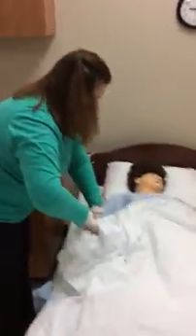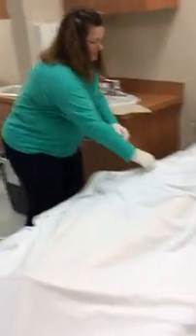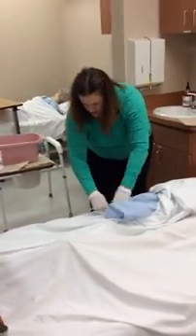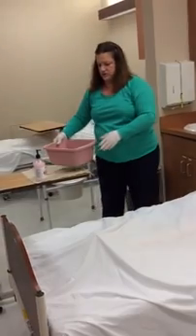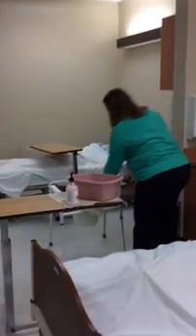Pull the blanket up, or the sheet up. Pull the bath blanket out. Make sure you roll it up. Get rid of it. Fix the sheet. Check the catheter tubing for kinks since you were just all up on her catheter. Now I'm going to get rid of my water. Make sure your water, anything from the waist down, you're going to put into the toilet.